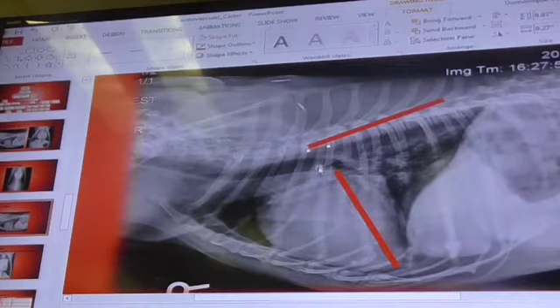Alright, so if that's the start of T4, you went 1, 2, 3, 4, 5, and about shy of 6. Did everybody get that for the long axis? Somebody got 5? Anybody get 5.5? Did anybody get 6? Okay, so you guys are on the right track.